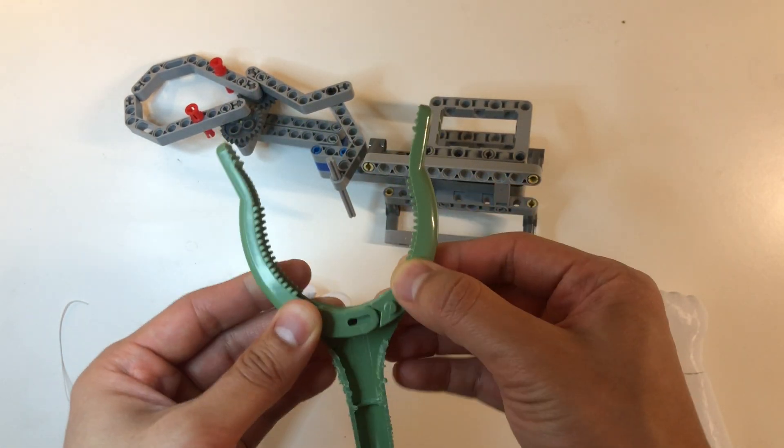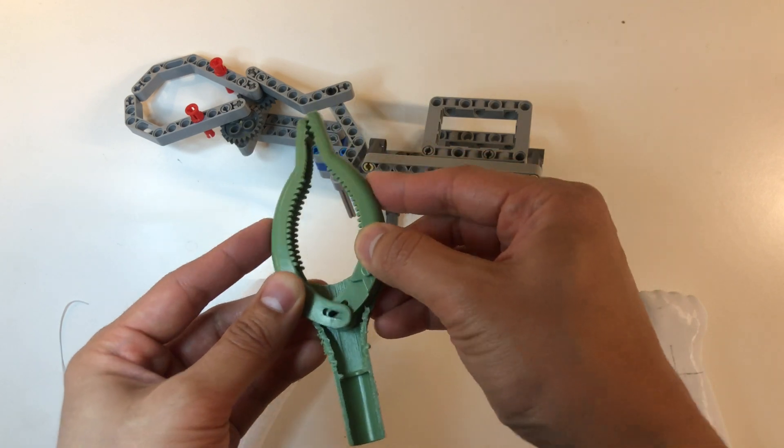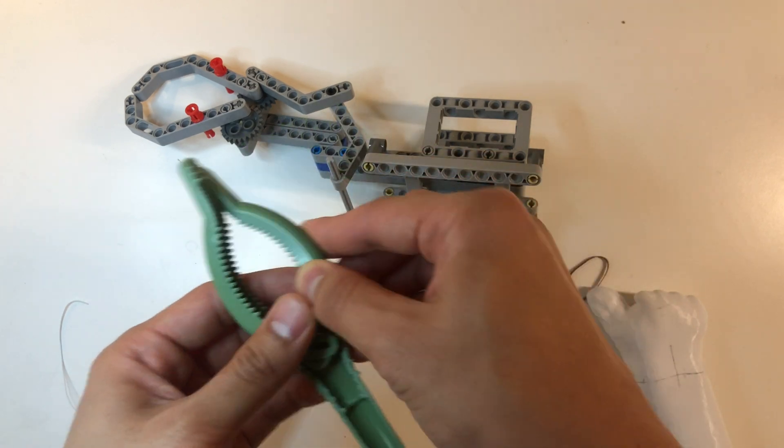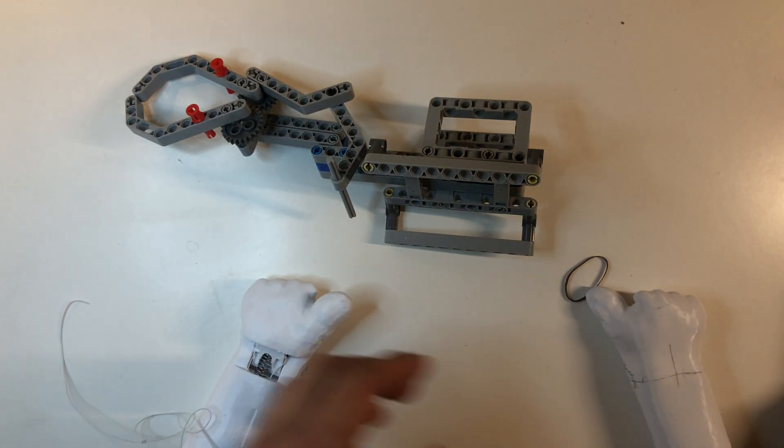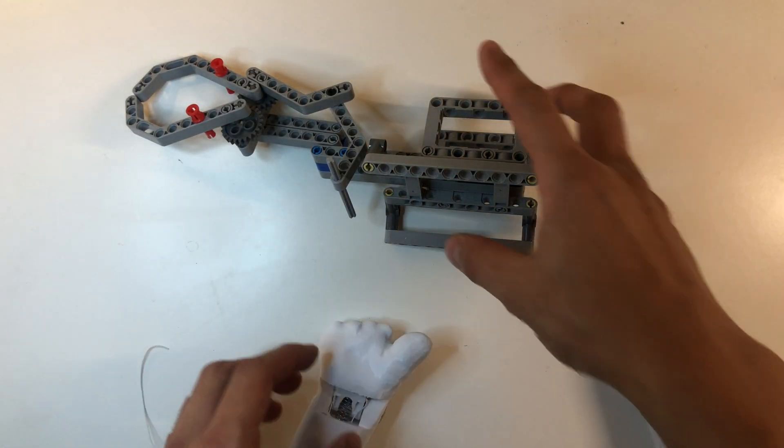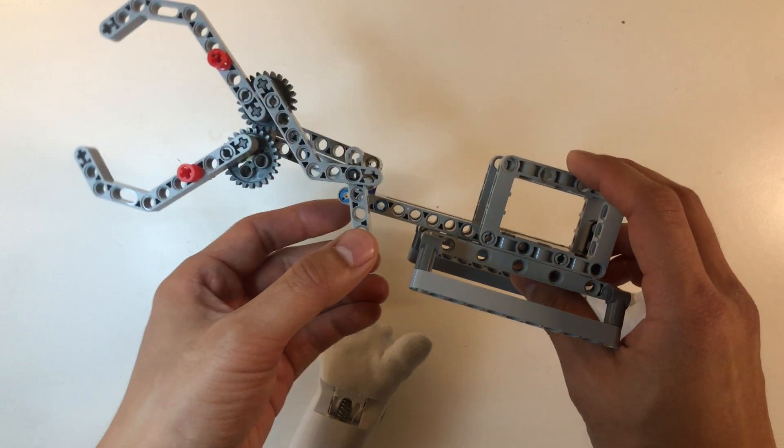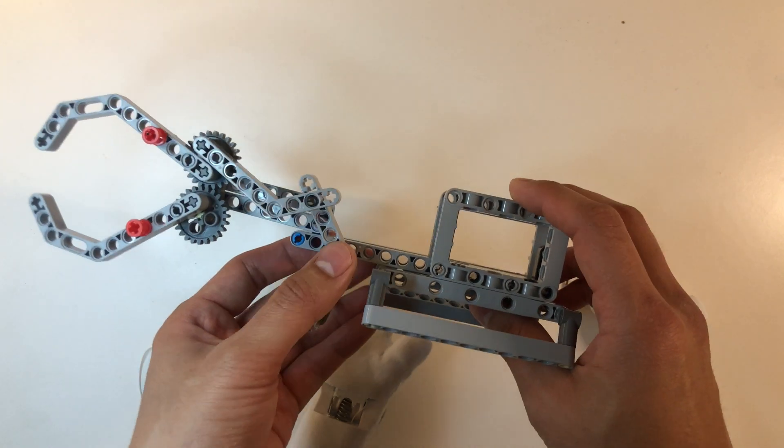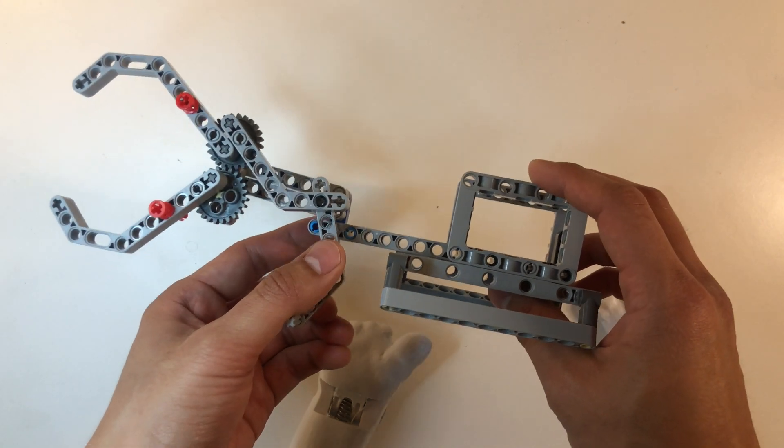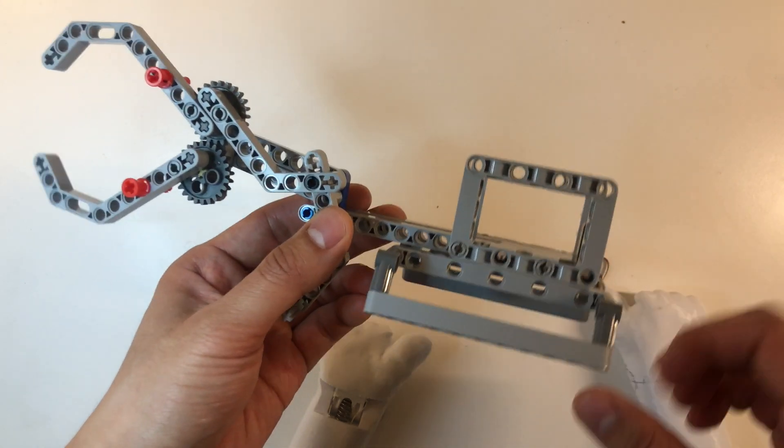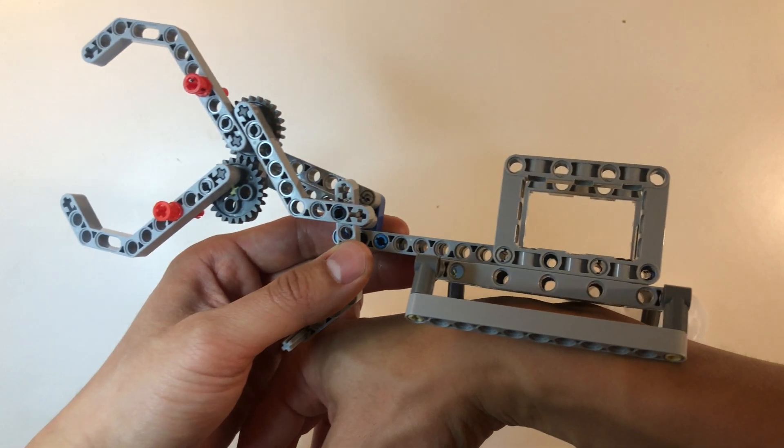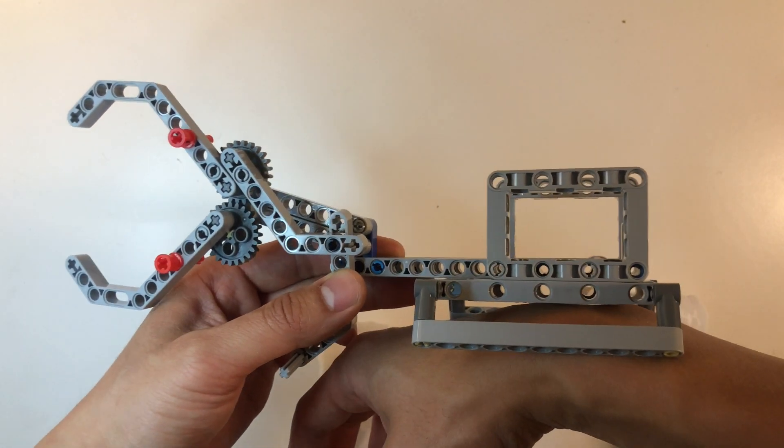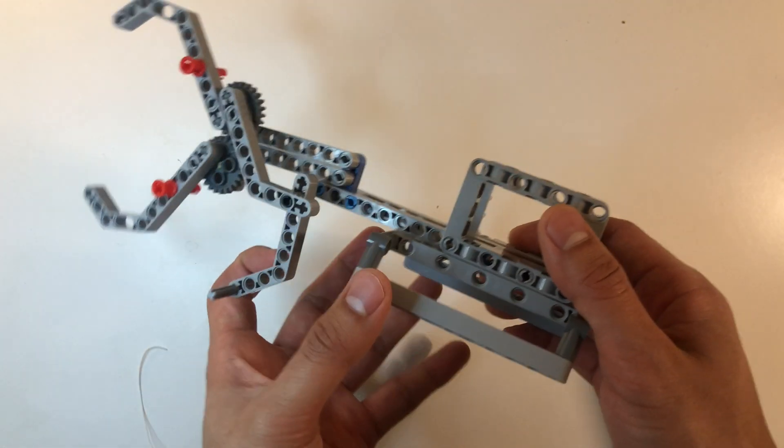These are the initial prototypes that we built using Lego Technic, and it will be something that's mounted on the top. So this is the first prototype.